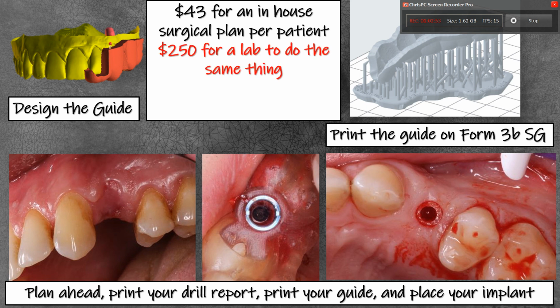files. Just doing some basic searching at laboratories, and I'm sure there are labs that are more expensive and labs that are probably a little less expensive. But for a lab to plan a single tooth implant for you to approve it, and for them to send you all the materials back, it looks like it averages about $250.